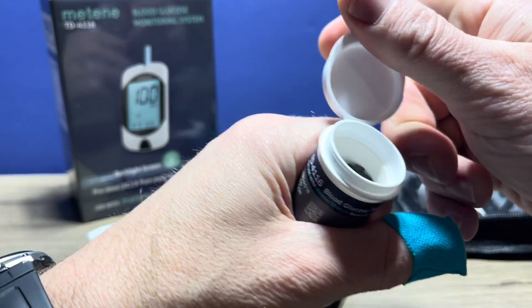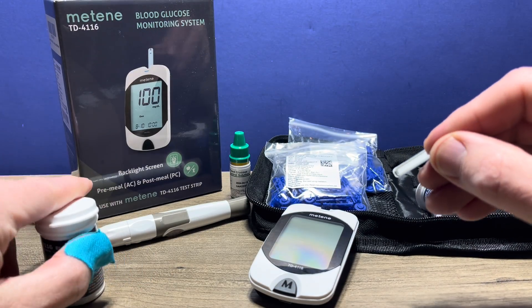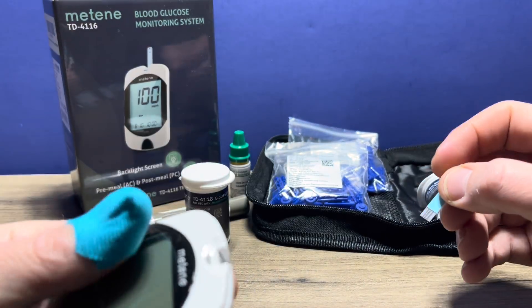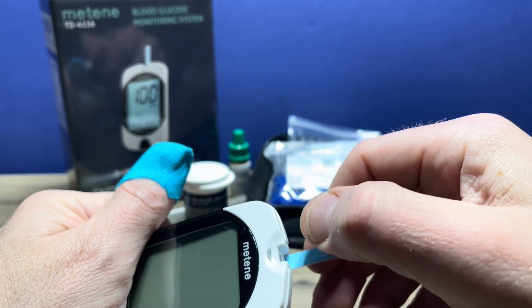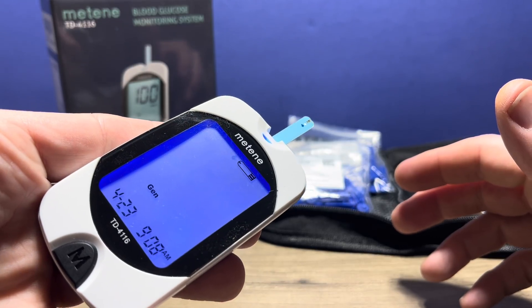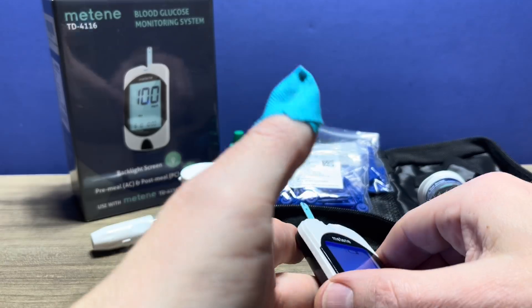And you'll get your test strip ready. Make sure you always reseal your test strip bottle after you remove a test strip. Then you put that in the top of the meter here, just like that. And then it will prompt you that it is ready to check — there's a flashing drop of blood there to let us know that.